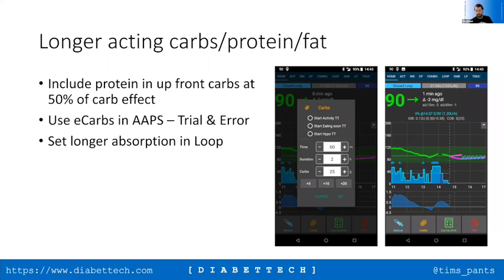And it can be quite challenging to deal with. What I have seen in the past people looking at is using diluted insulin for something like that. That's the issue with it. I don't think it's anything you're doing wrong. I think the low levels of basal rates are resulting in SMB requirements that can't be delivered by the pump. Yeah, I mean, we've noticed that it will deliver in increments of 0.2 and 0.